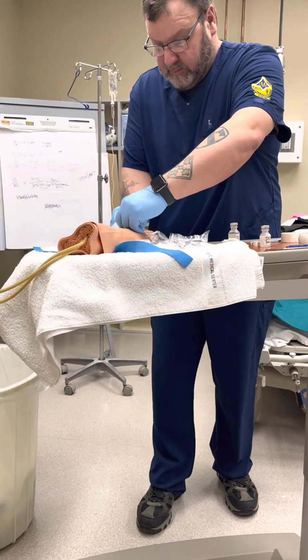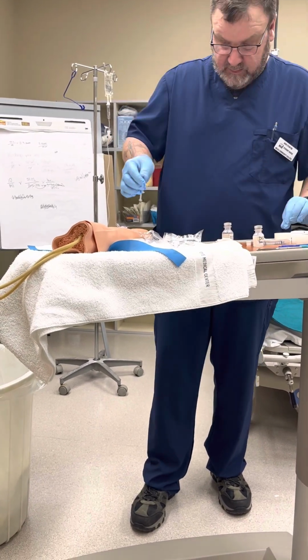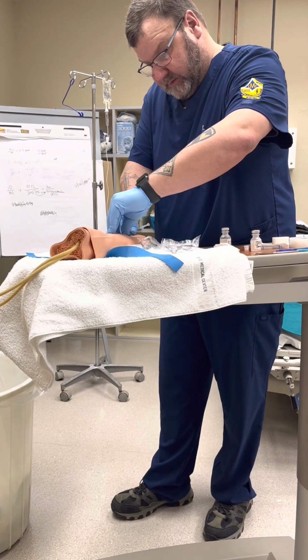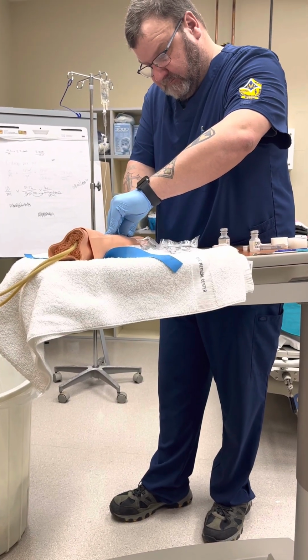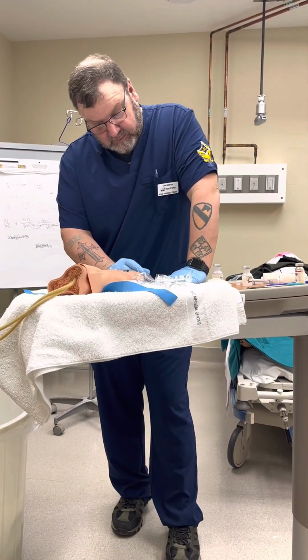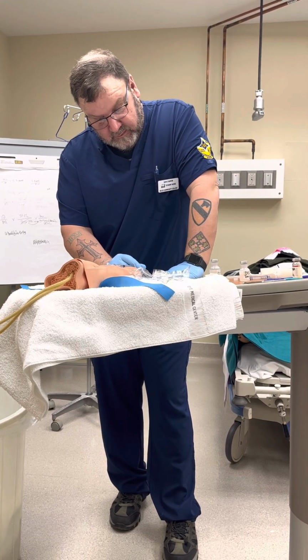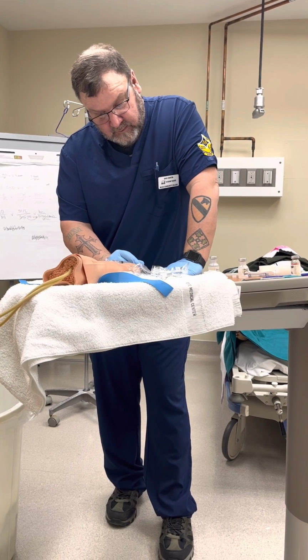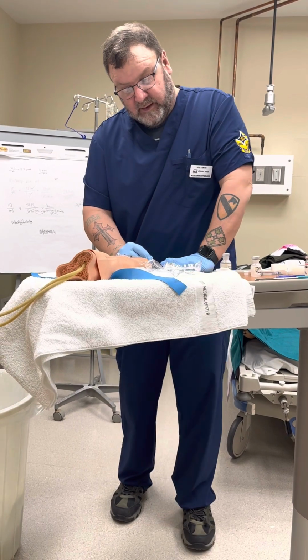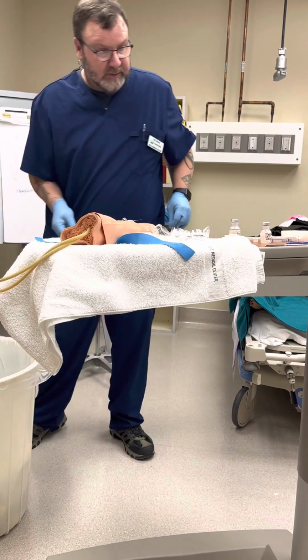Clean my cap with an alcohol wipe, double OK method. Remove my cap, insert my medication, and then I'm going to push this over 4 minutes, 1 milligram per 2 minutes. 4 minutes have gone by, medication's in, goes into sharps.